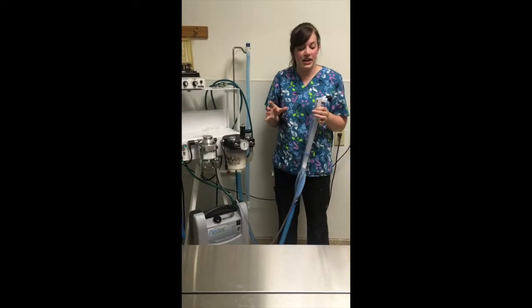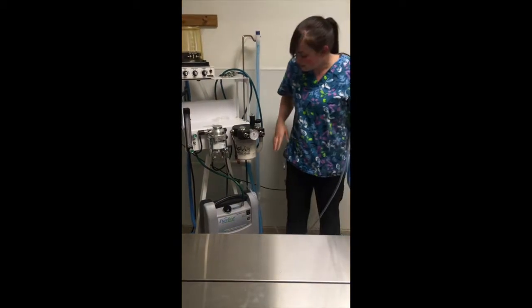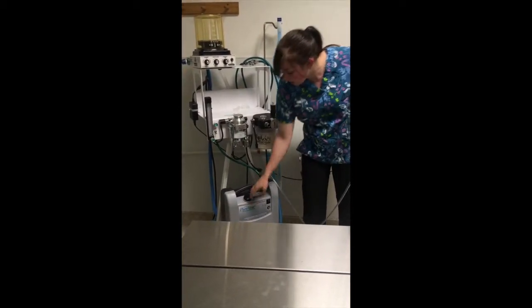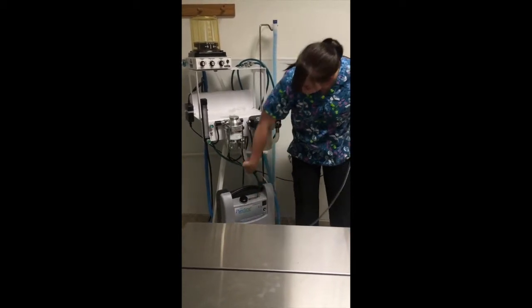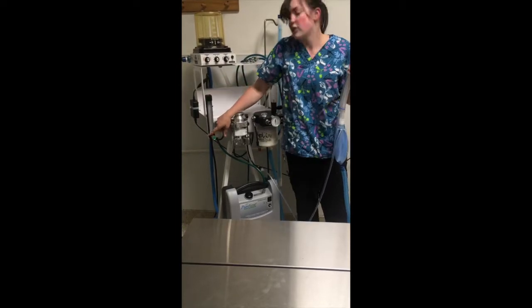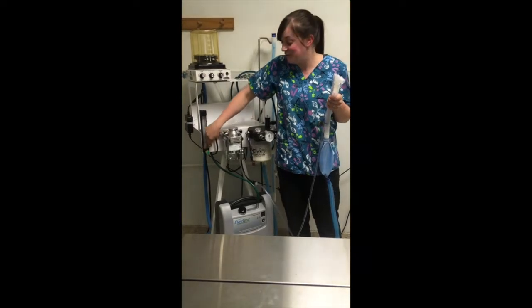Alright, I'm going to be talking about the non-rebreathing system. So this non-rebreathing system is hooked up to our oxygen supply. Our oxygen, first off, is an oxygen generator. So this oxygen generator is hooked up to our flow meter. This is going to, we can change this to the amount of oxygen we want to flow to the patient.